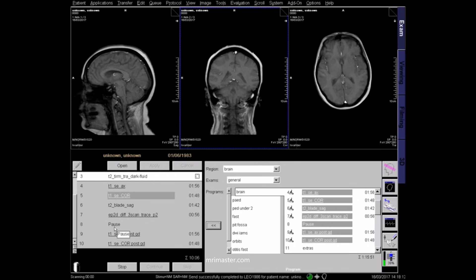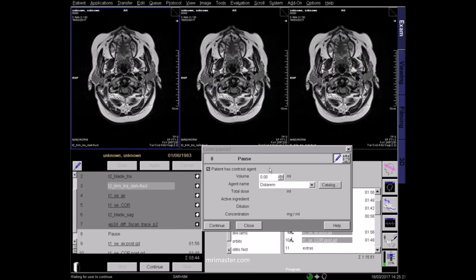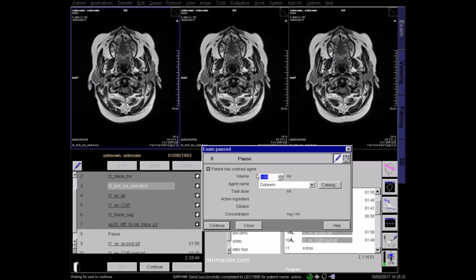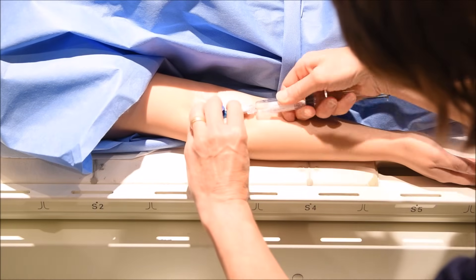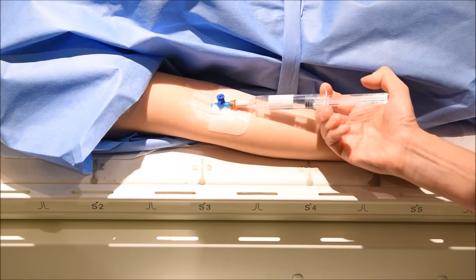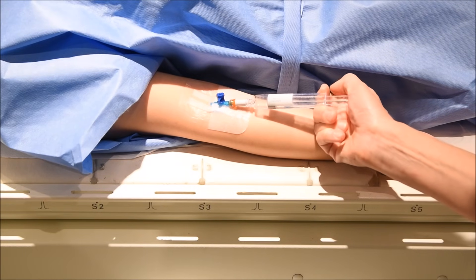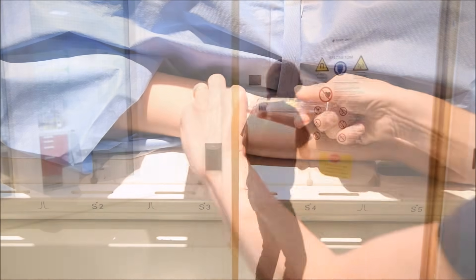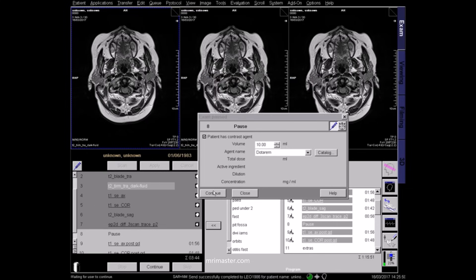Once the pre-contrast sequences are complete, make sure the correct contrast name and volume are entered into the scan details, following radiologist or hospital protocols. Remind the patient to lie still, as they may need to be moved out of the scanner to administer the contrast. Inject the contrast following the hospital and manufacturer's guidelines. Check that the contrast has not tissued or extravasated and that the patient is feeling well before you leave the room. Now continue with the post-contrast sequences.